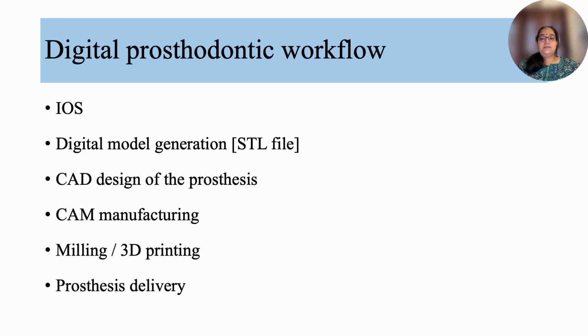Once the scanning is completed, the digital workflow begins. The intraoral scanning first captures the data, and then we generate a stereolithographic STL file, a standard tessellation language file. CAD/CAM software is then used to design the prosthesis, and then a CAM machine is used for manufacturing, either in the form of milling, which is subtractive manufacturing, or 3D printing, which is additive manufacturing, and the final prosthesis is delivered. The entire workflow reduces manual laboratory procedures and improves precision.